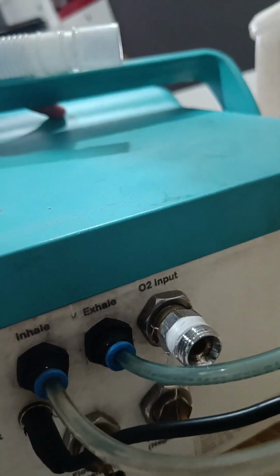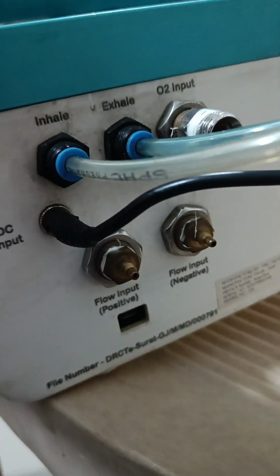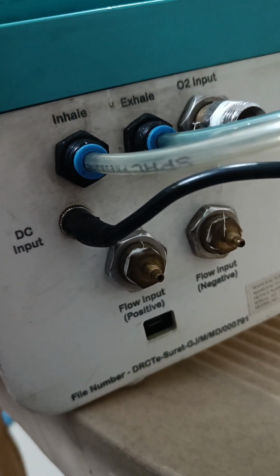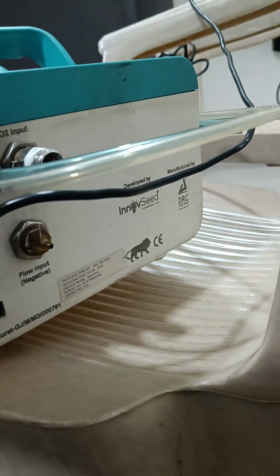All kinds of O2 connections can be given directly, and you can manage the flow from the program itself. Flow input is there, positive flow input, negative flow input, everything is there. This works with any DC output and input.